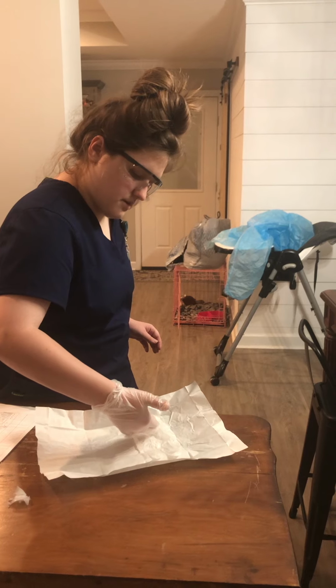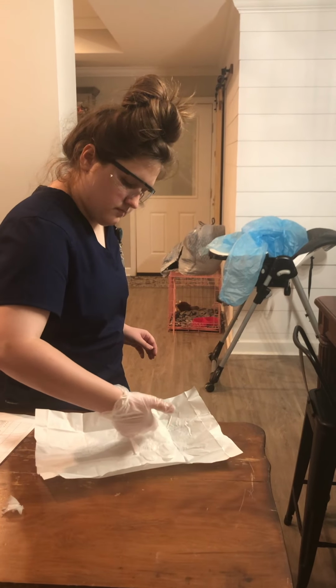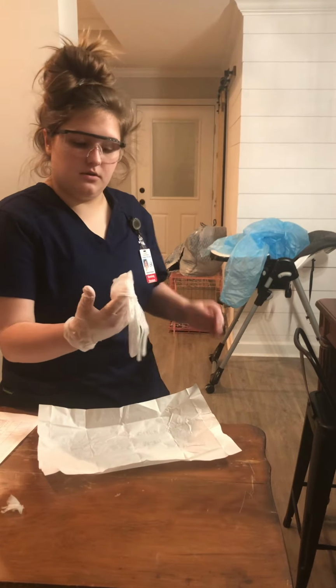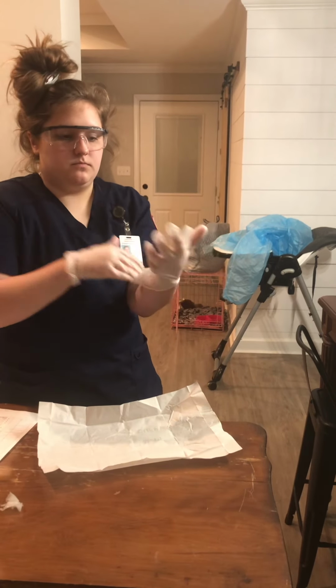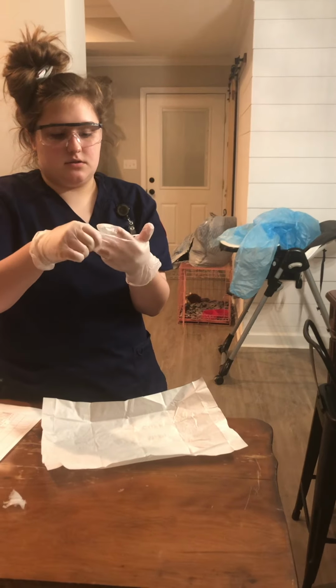Okay, there we go. And I'm just going to fix this.